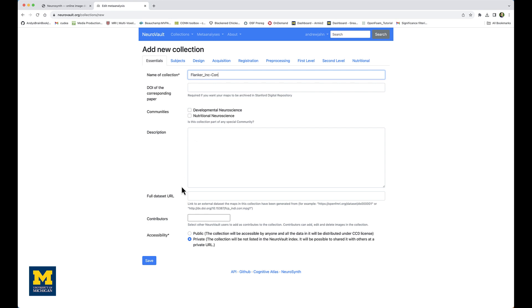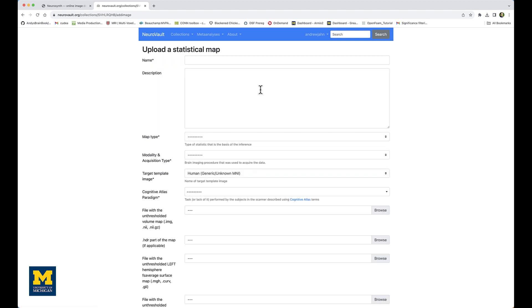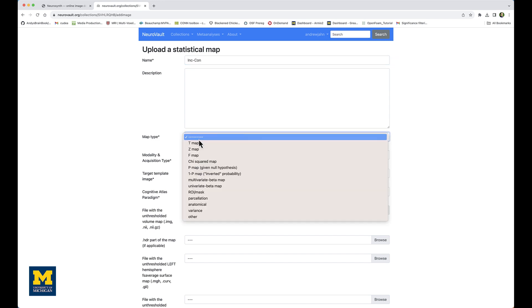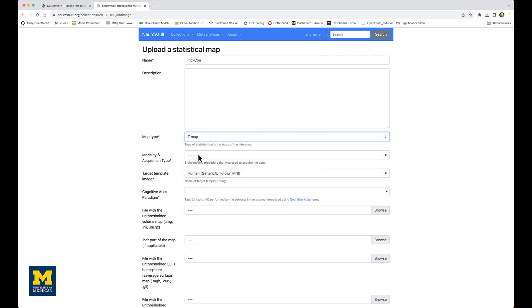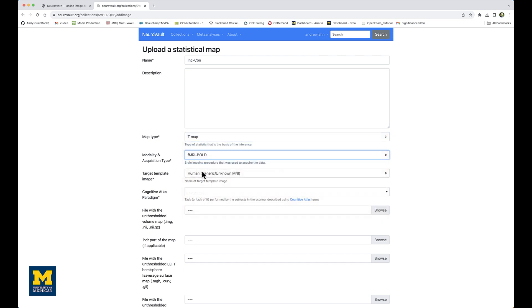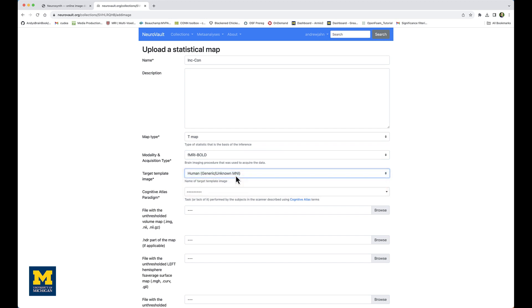Then I click on Save. Notice I'm only filling in the required fields. On the next screen, I'm going to select 'Add images one by one' because in this case I only have a single t-map group image. And here, everything with an asterisk needs to be filled in, such as the name, let's say inc-con. The map type is a t-map, modality is fMRI BOLD, and for the target template we'll select Human Generic Unknown MNI.